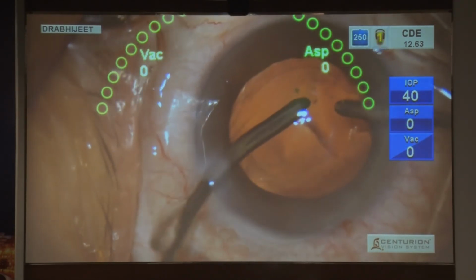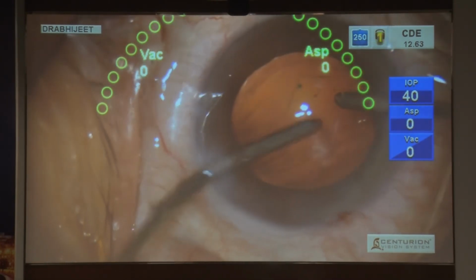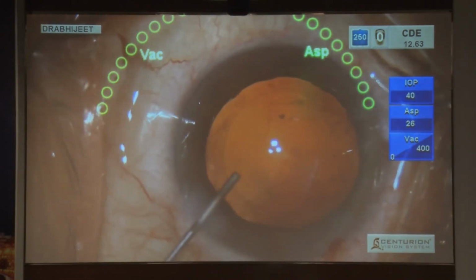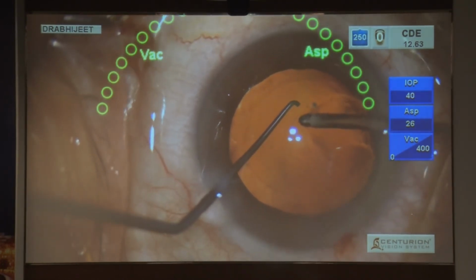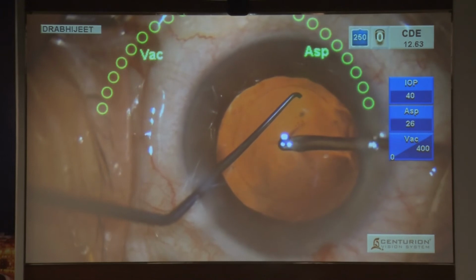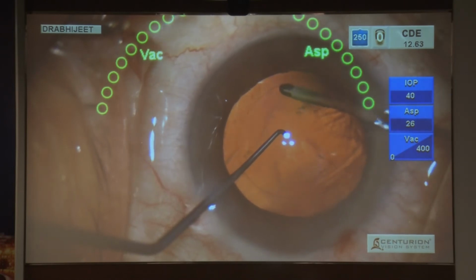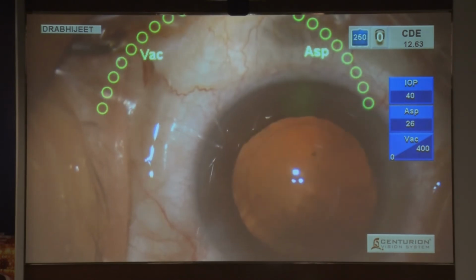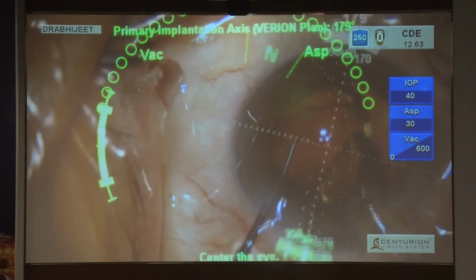Like Dr. Nagvekar, even I like to do a rigorous PC polishing, but if I don't check the edges of my bimanuals, this is what I get sometimes. Fortunately, there is no vitreous tag. I have put a dispersive viscoelastic. This is a small technique you should master because many times the flap tends to go into the vitreous and it's difficult to hold it. So you may use a second instrument to do an assisted PCCC and complete the PCCC here. And because this patient was for a toric IOL, I could end up putting in a toric IOL and it's a happy story.